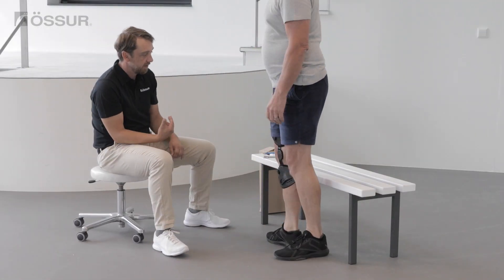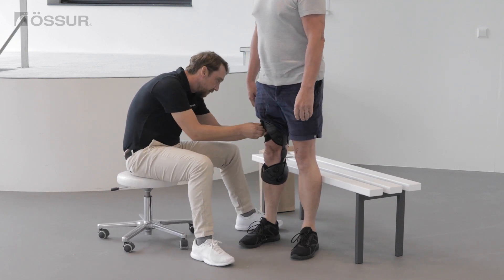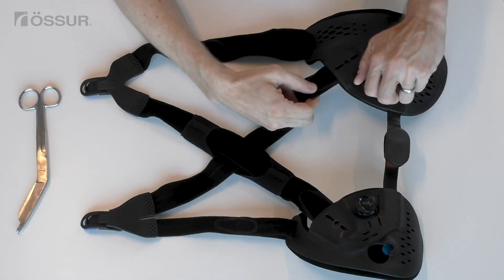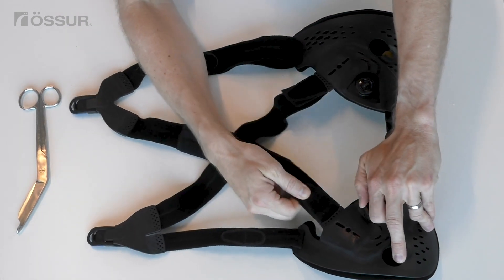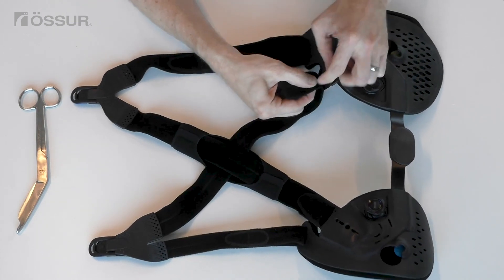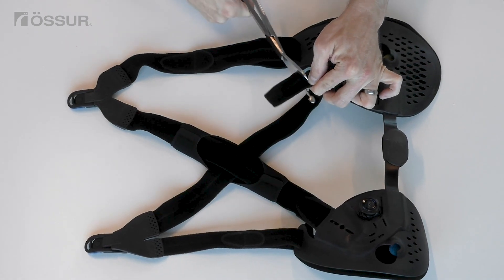Verify brace positioning and the optimal DFS strap tension based on the user's feedback. Aim for a final smart dosing setting at the middle position. Undo the brace and remove it from the leg. Loosen both smart dosing dials so the alligator clips are visible. Trim the straps to the appropriate length.